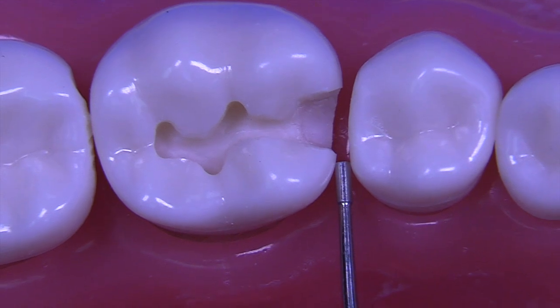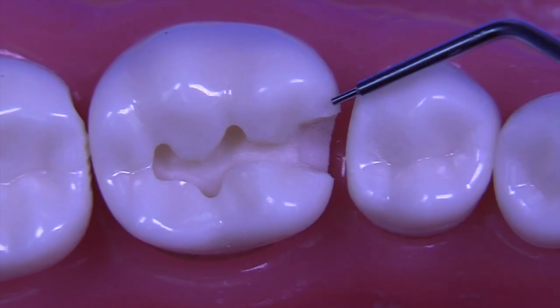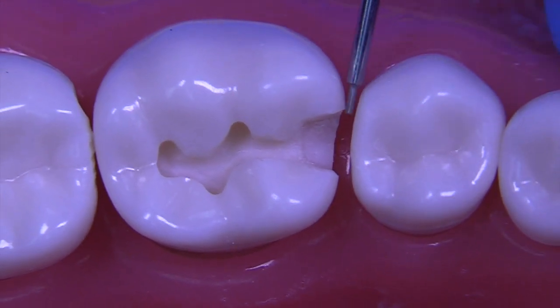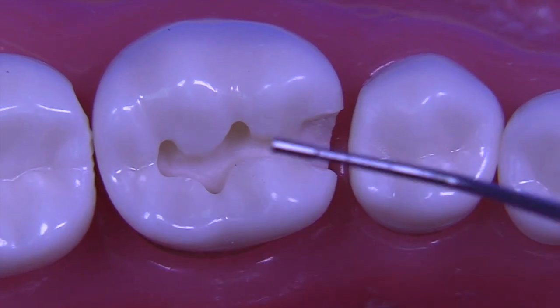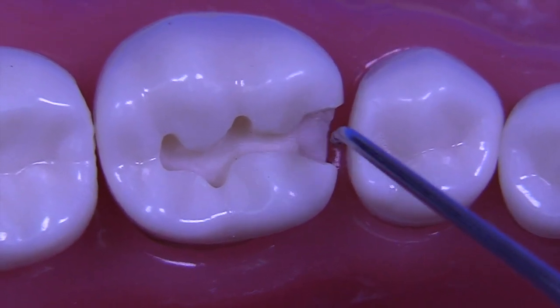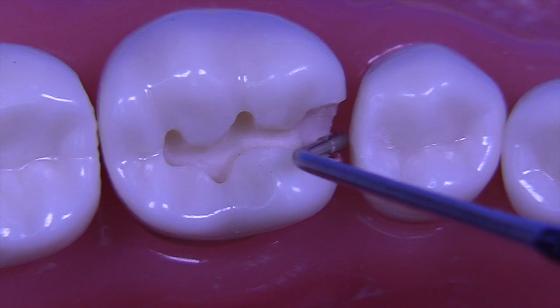But in this case, it won't fit on either side, so we can feel pretty good about this extension being within the acceptable range. Perhaps not ideal, but acceptable. The other thing you want to look at is the gingival. And the gingival extension, that means the space you have between the gingival margin and the adjacent tooth is going to be at least 0.5 millimeters and probably in many cases around a millimeter. And you're right in that zone.